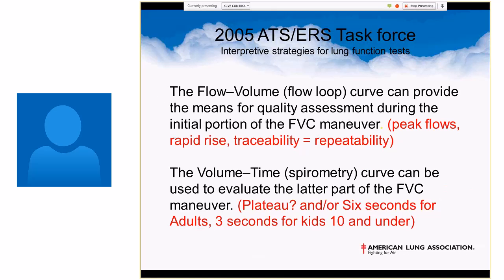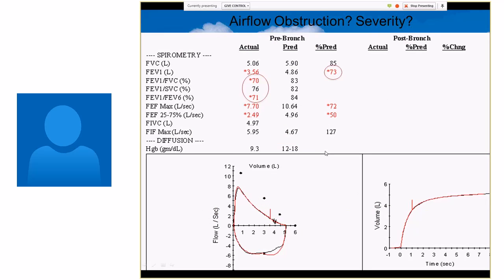The flow volume curve can provide the means to assess the quality during the initial portion of the vital capacity maneuver. Peak flows, rapid rise, and traceability equals repeatability. The volume time curve can be used to evaluate the latter part of the vital capacity maneuver. Did it plateau? Did they blow for six seconds? Little kids only have to, under 10, only have to blow for three seconds.